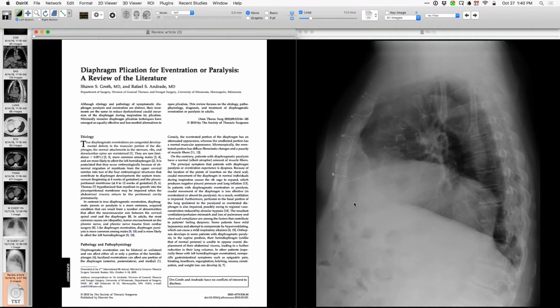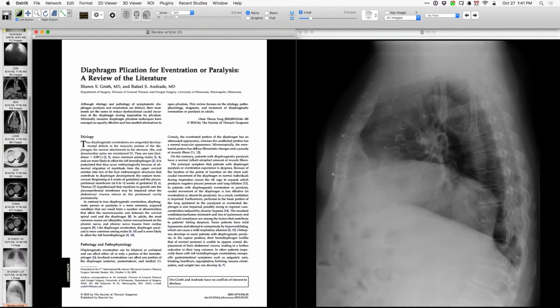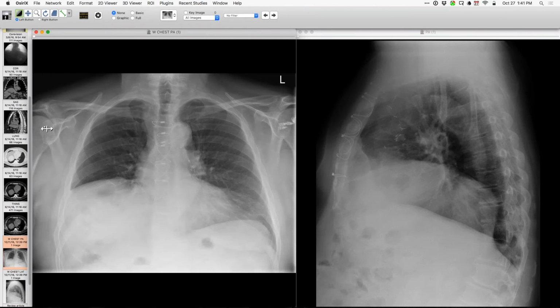And I don't know whether his symptoms are going to improve and to what extent his symptoms are even due to this, because apparently there's a note in the chart here that said that this is unchanged from a chest radiograph from 2001, which I couldn't find. So I'm not sure to what extent this person's symptoms are due to this eventration, but I thought this is a really nice example of eventration rather than paralysis. David, I thought you'd like that case. Absolutely. So it's definitely eventration and it's not paralyzed.